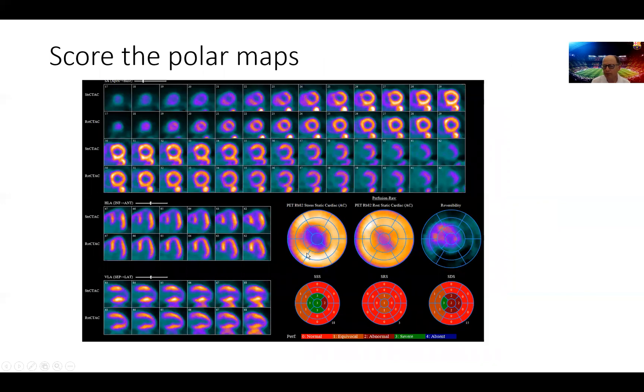We go to give a meaning to these observations on a 17 segment model. So here we can see this minor or minimal perfusion defect in the apex in the rest images in the 17 segment plot.